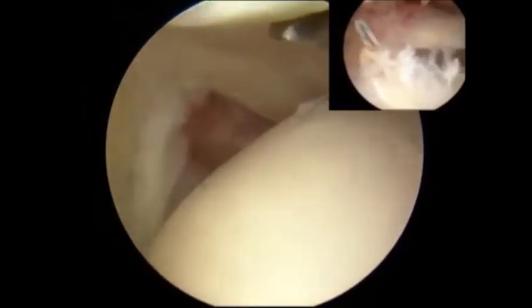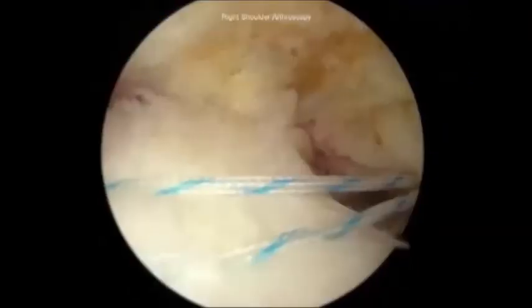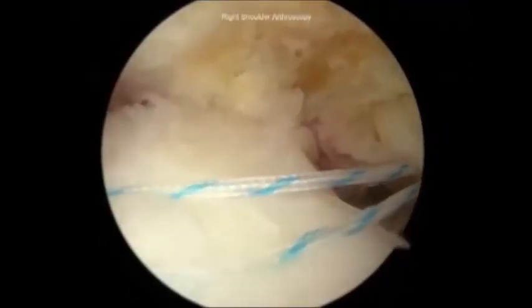The third and fourth sutures are passed, and then, starting with the most posterior suture, the rotator cuff is repaired down to the footprint. In this case, using a sliding knot with half hitches.